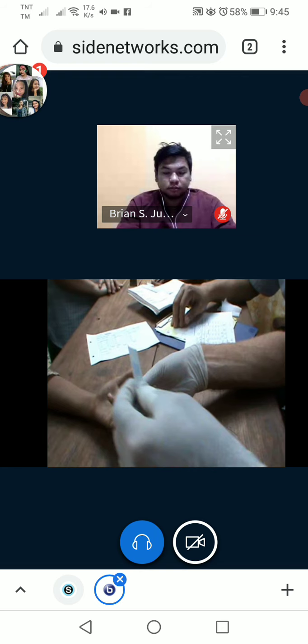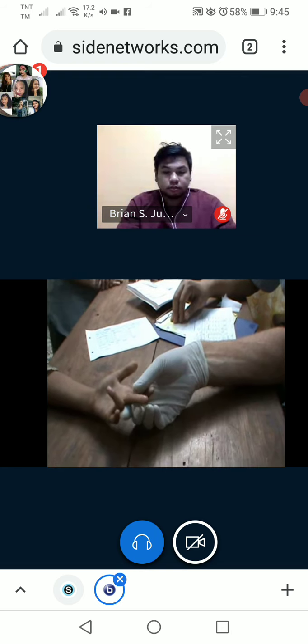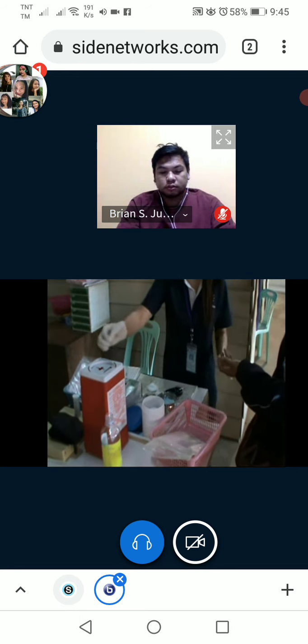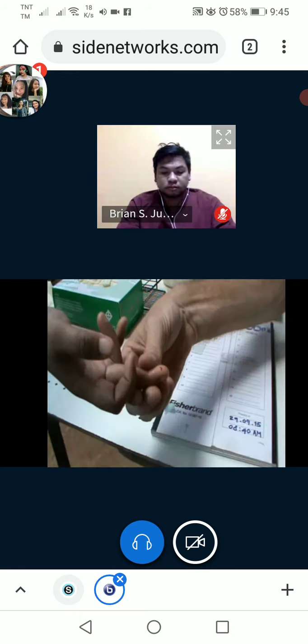If you notice the protective wrapper has already been torn off or damaged, discard the blood lancet as it is no longer sterile and use a new one. Pull the lancet out of the protective wrapper and prick the side of the fingertip with a quick hand rotation. Discard the used blood lancet in a proper bin. Press slightly the finger. The blood should come out easily. If not, restart by cleaning and pricking another finger.